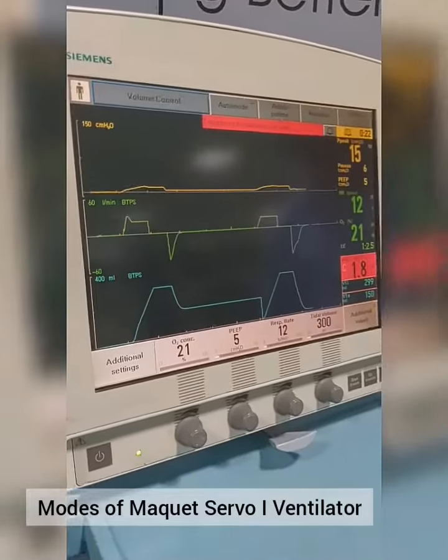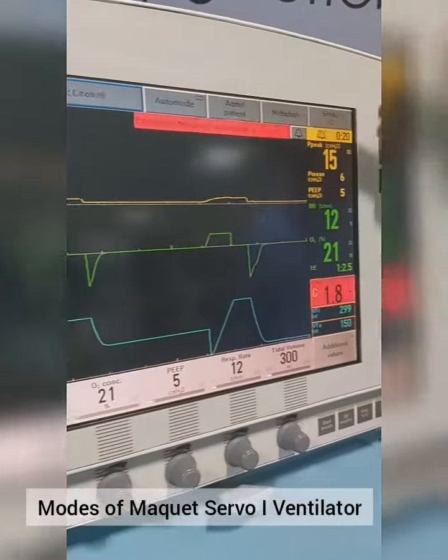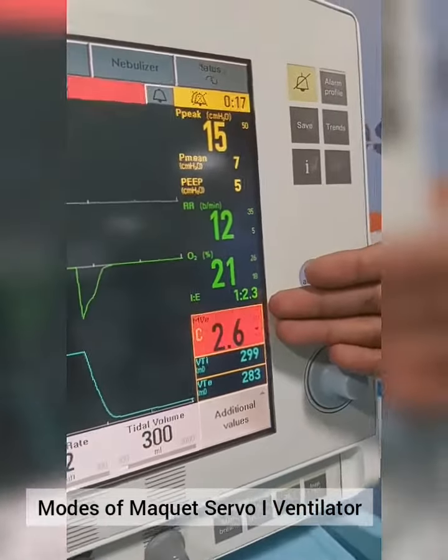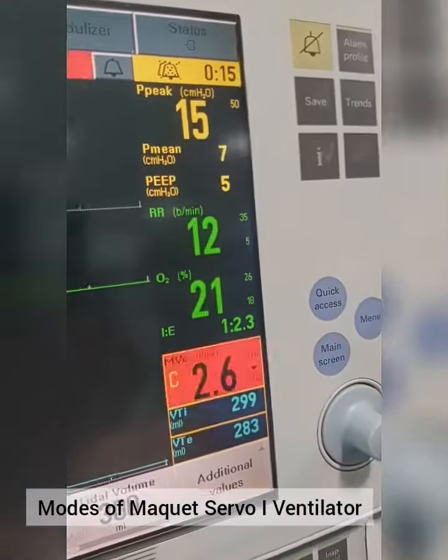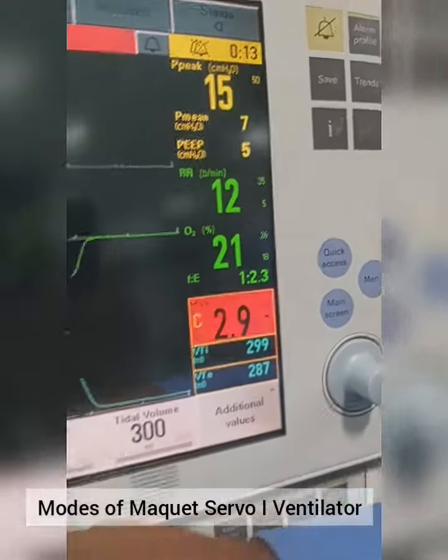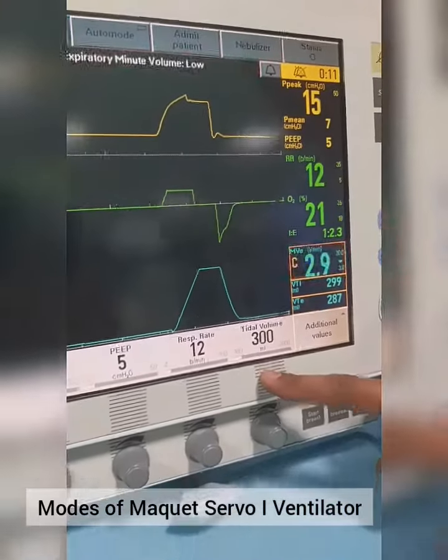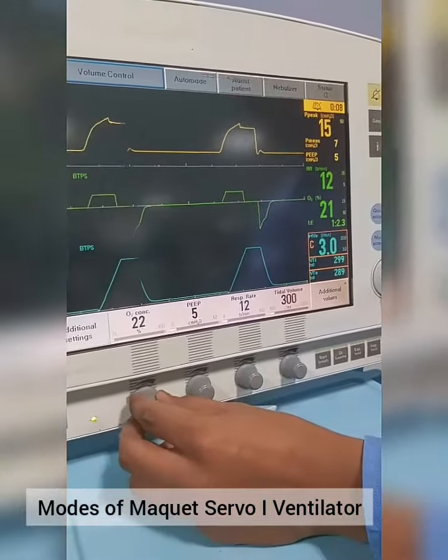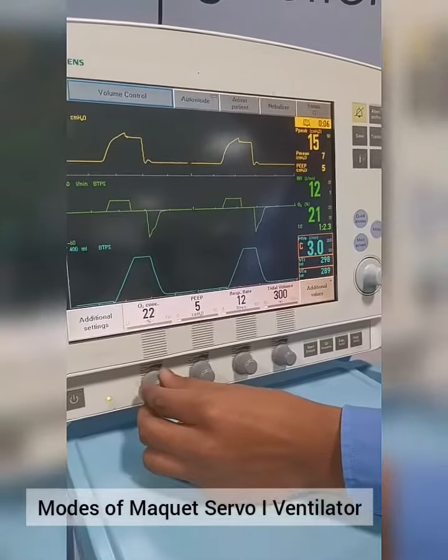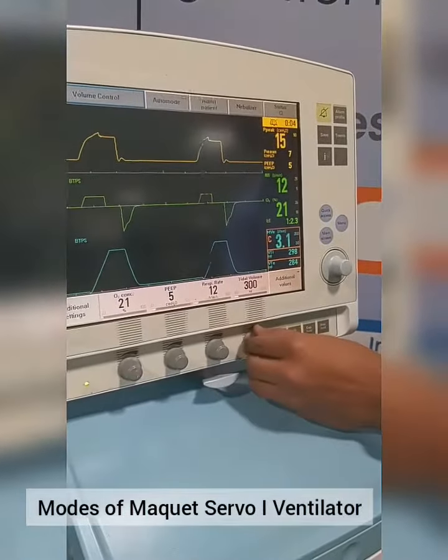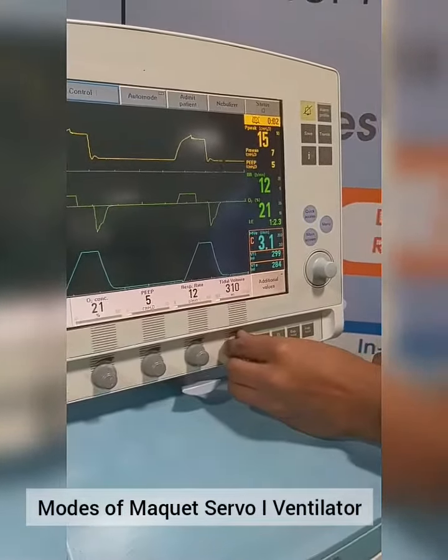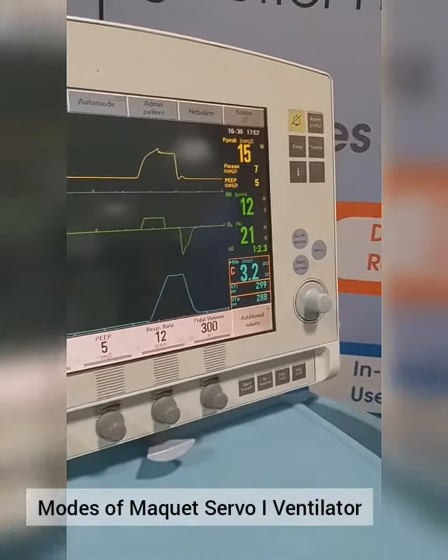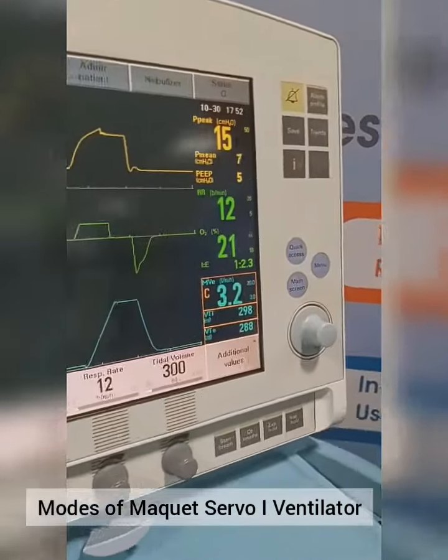This is the Main Screen for Ventilation. These are the Delivered Parameters. These are the Basic Setting Parameters. We can set these parameters by Soft Key. And these are your Delivered Parameters.